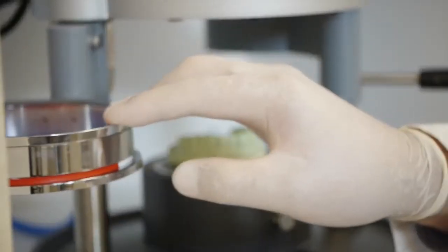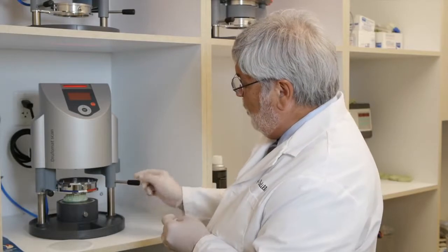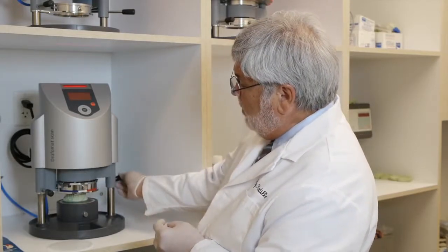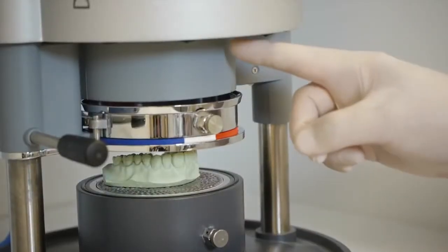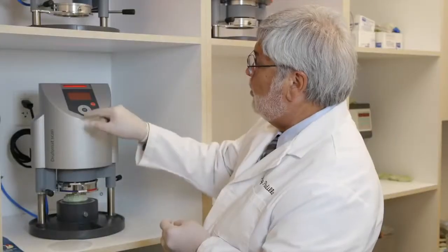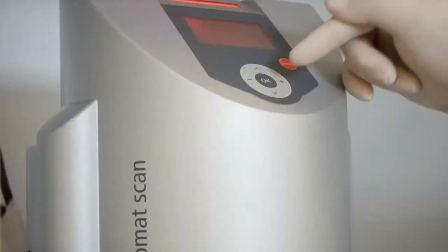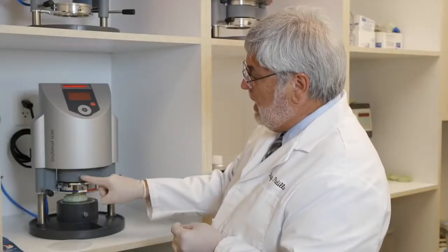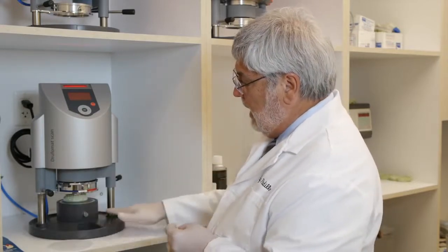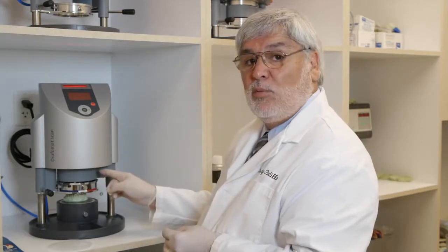Now I'm going to place the mouthguard material over the model, and I'm going to initiate the heating element over the material. Now the heating element, the material, and the model are all lined up directly. Now we're going to press OK. OK will start the heating process. When I press OK, you should see lights light up here. And you'll see a pink light haze right here. That tells you that the heating element is working.